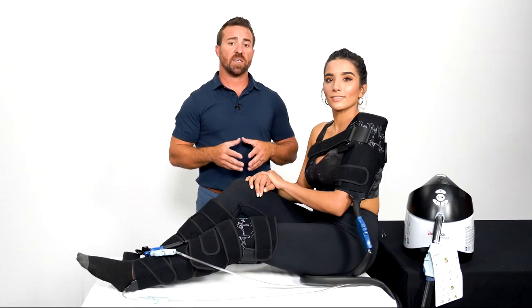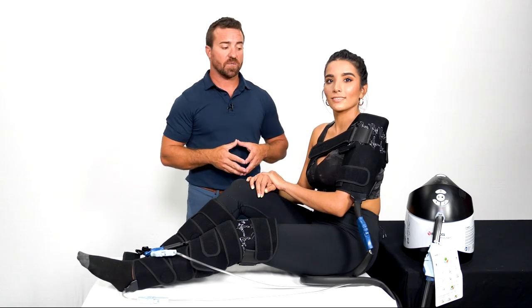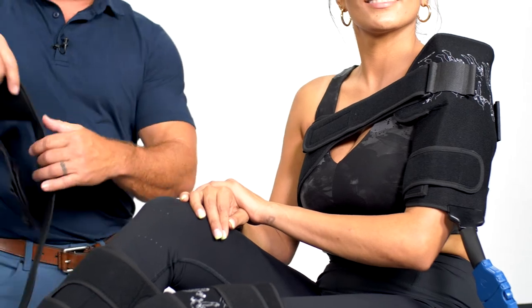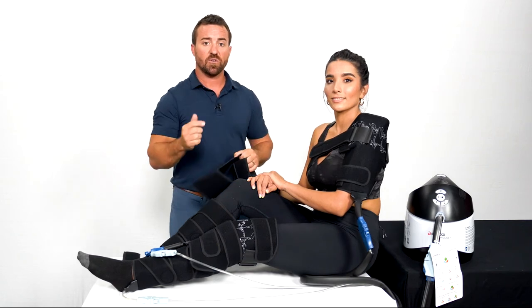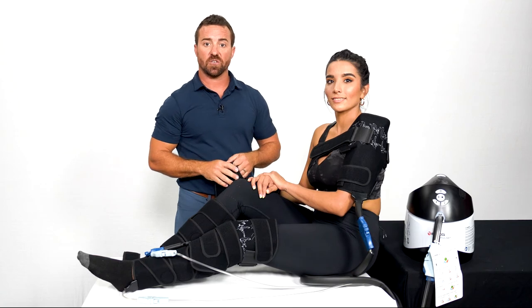Now that we know how to set up our vPulse, let's go to our patient and see how to apply the different wraps. For the universal wrap on the shoulder, we're going to use the long strap with the curve in it. This goes under the armpit and connects via velcro to the cold wrap, using a short strap to go under the arm to secure the cold pad to the shoulder.